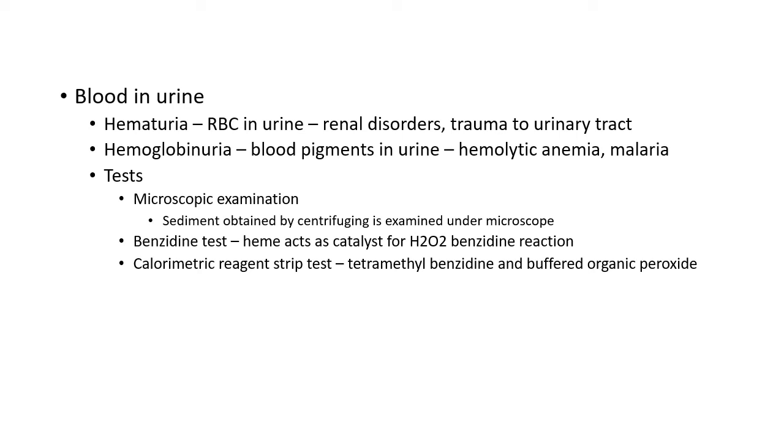Blood may be found in urine in the form of red blood cells or blood pigments alone.